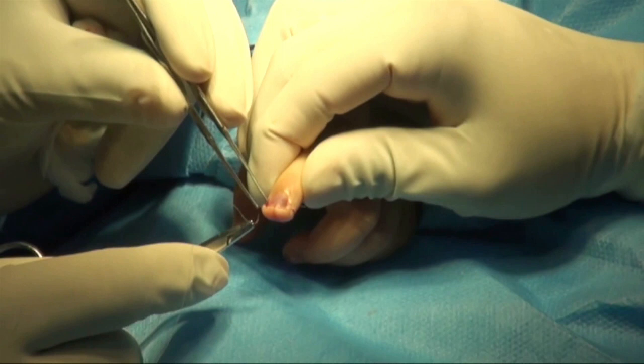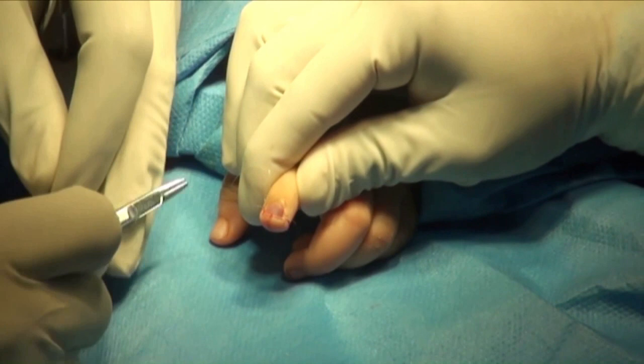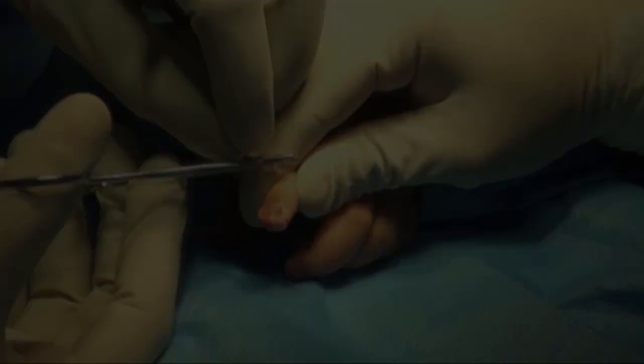The assistant's job is to hold the part stable till the end. I myself shall cut the suture material. The needle should not cut through the flap at any cost.